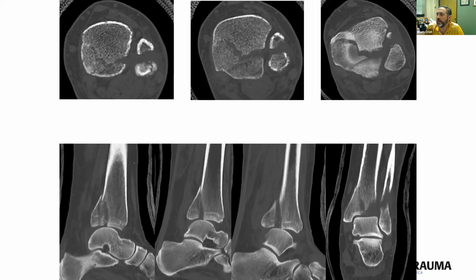I would be a little bit hesitant to only do that, because I think if you do a posteromedial approach, you should be able to see, at least distally, the joint surface better, or at least get a peek at it as far as how well aligned it is. And so as long as their soft tissues could handle both approaches, I think that would be the exposure that I would do. And then Tim, how to regain length on these?